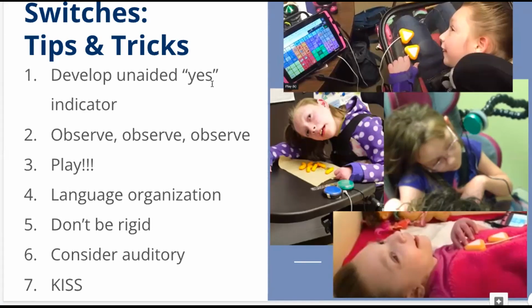Well, what appears to be aimlessly, but this is part of the language learning, motor learning process, and they're just checking it all out. So they scroll for months on end, and then make selections when appropriate. And so it's okay. Don't inhibit it.